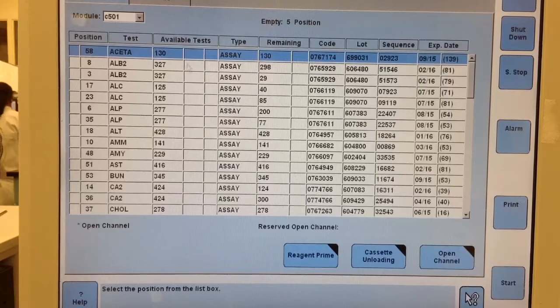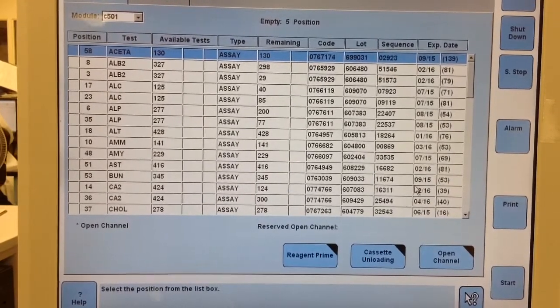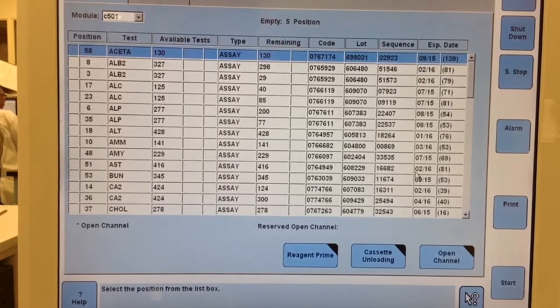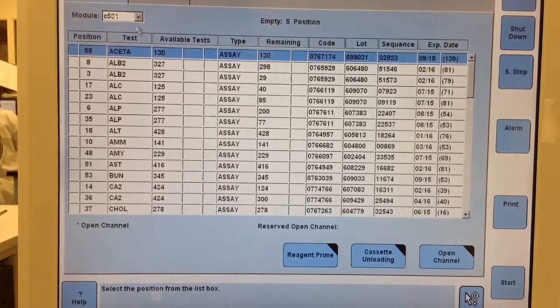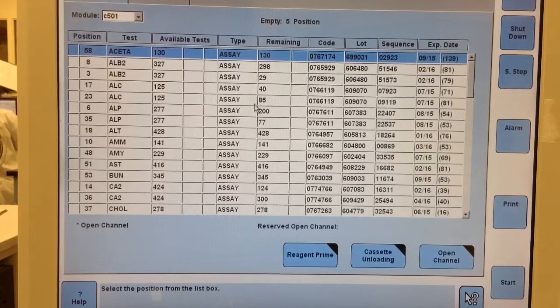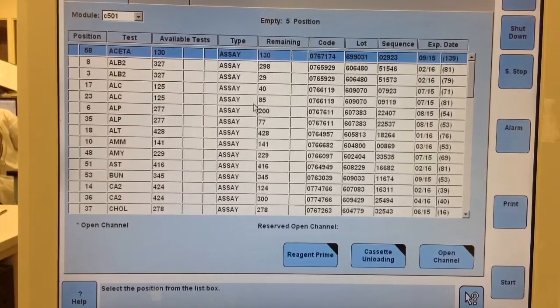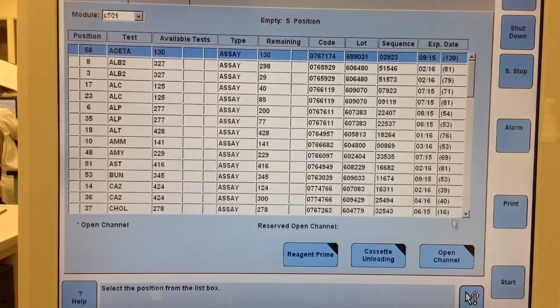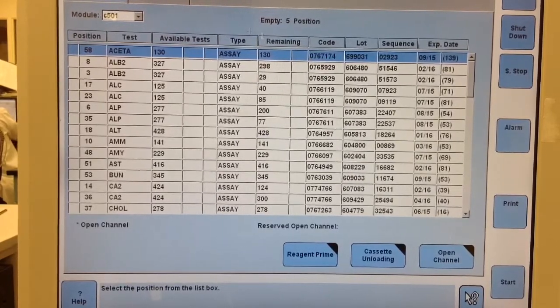Now, after you have waited your 30 minutes, or like I said, you could put this on and then wait 30 minutes, but to do that, you have to make sure you're in standby, then go to reagents, and you have to dump any of the open channel reagents still on board. So I had a few of the gentamicins left before I made up this one, and I went ahead and dumped that already.